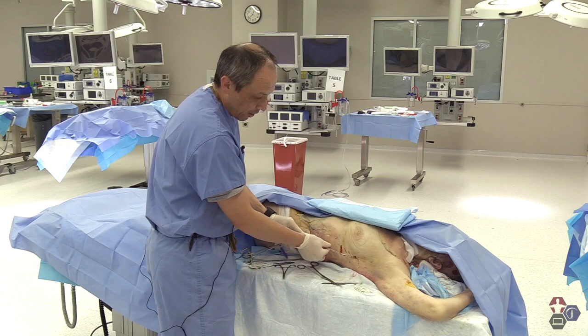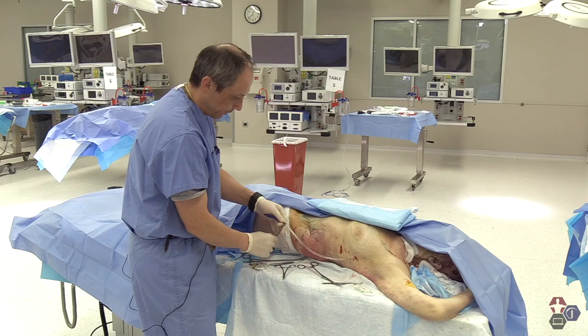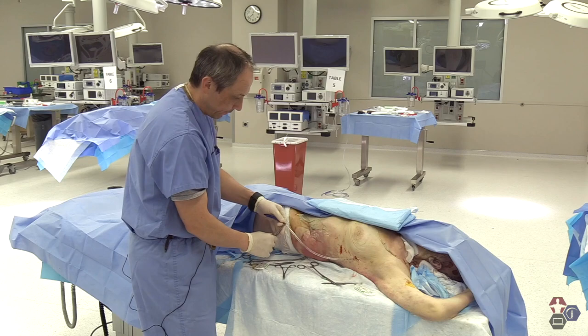I also like to put one extra tape chevron here, as well as towards the distal end where it attaches to the Pleurevac. And from here, this ends the conclusion of the chest tube insertion.